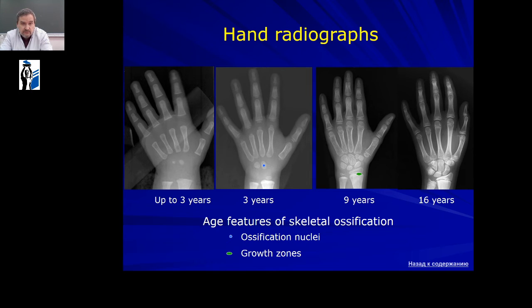Age features of skeletal ossification, and we can see ossification nuclei and growth zones. Growth of the skeleton lasts until 25 years.